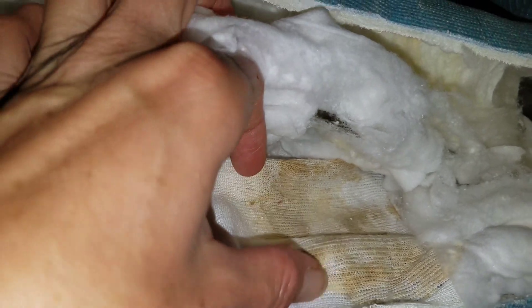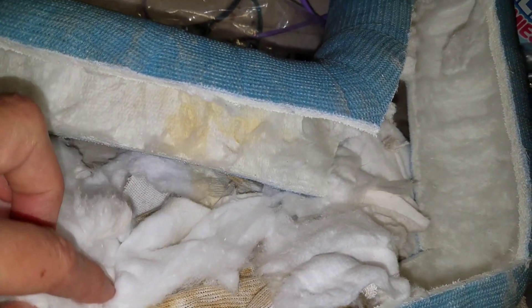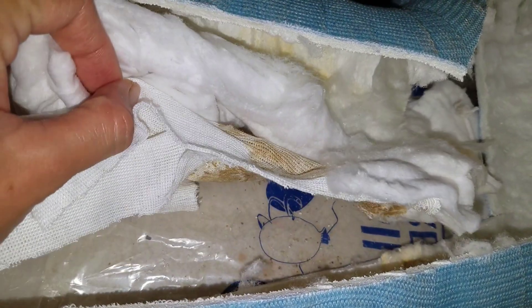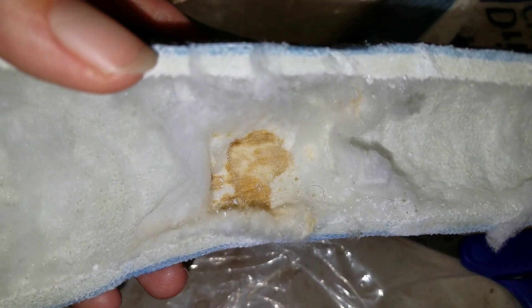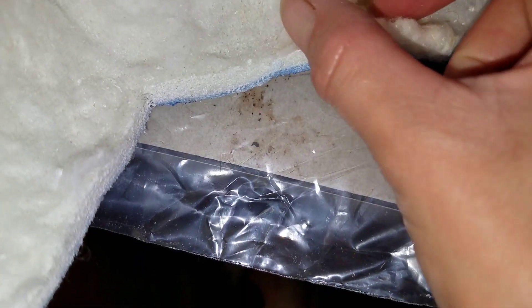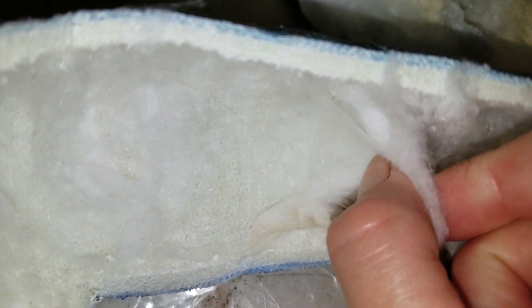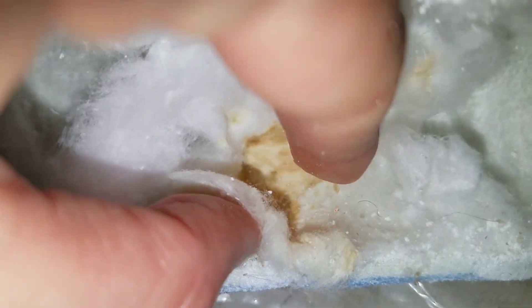But if you do break a bone, you have to get a cast — there's really not any options for that. Maybe at a bigger hospital they might have other options, but this is all we had available to us, and it turned out pretty bad. So this was one of the worst spots on her arm — it's the most raw. You can see where the bone breaks; this is right where it's broken. That's where there is a lot of damage to her skin.